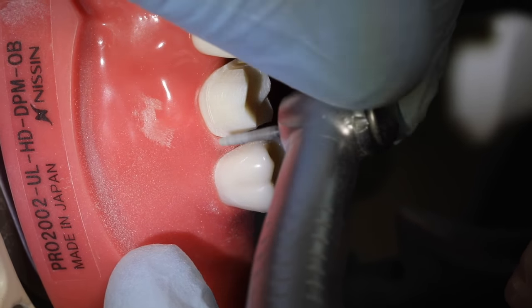Check ourselves. So we'll resume our lingual axial wall, or palatal axial wall, reduction with some direct vision.